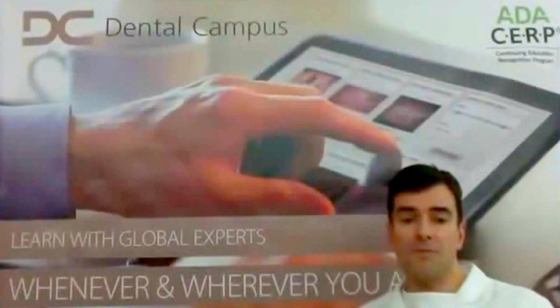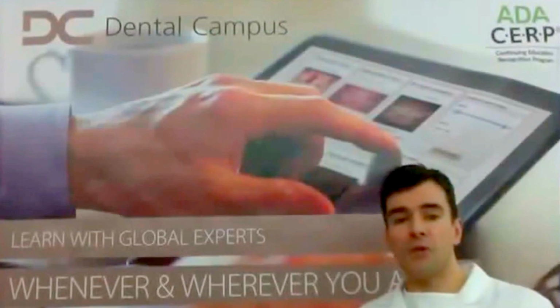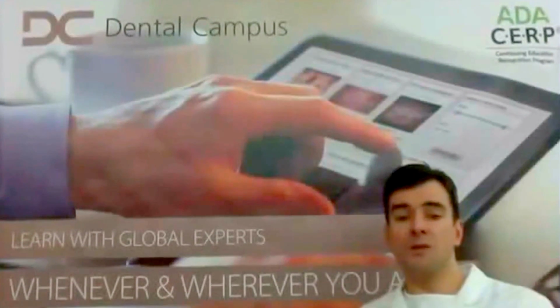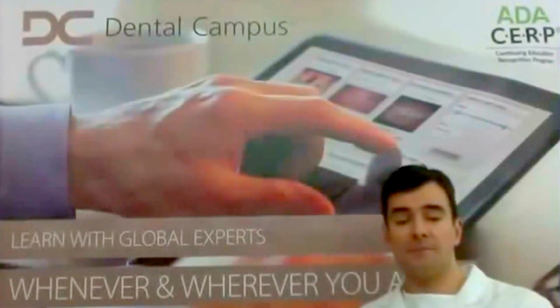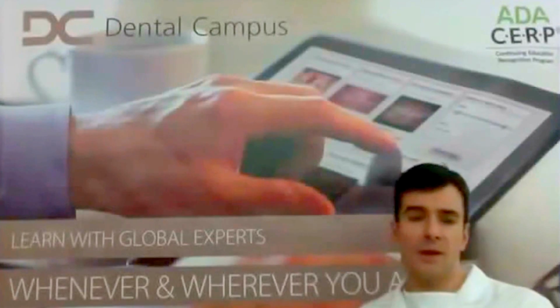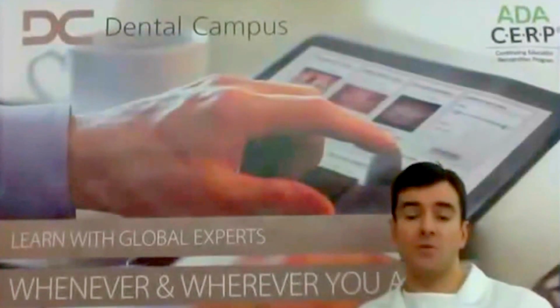So in our clinical practice, in the front region, we generally go for type 2 implant placement. So up to 2 months after extraction, we place the implant. Of course, in this case, the bone substitute is not yet integrated, but our main goal is to keep the volume of the soft tissue.